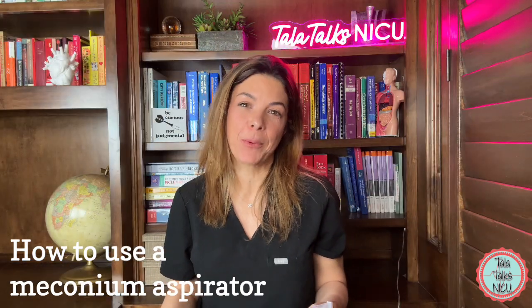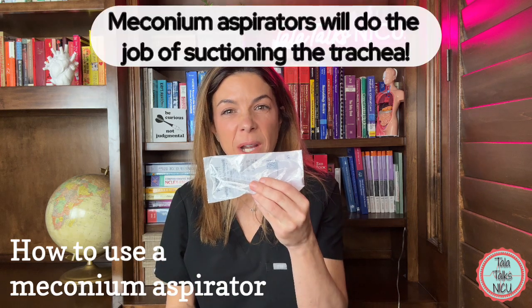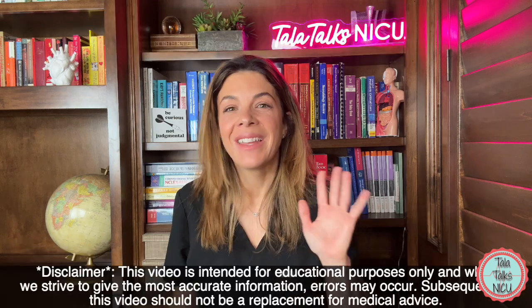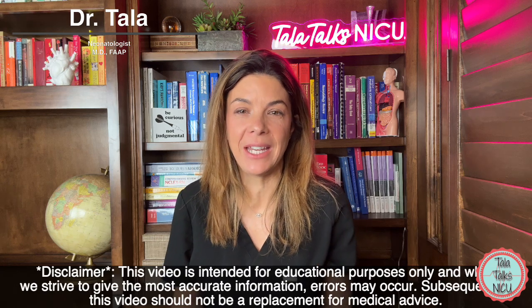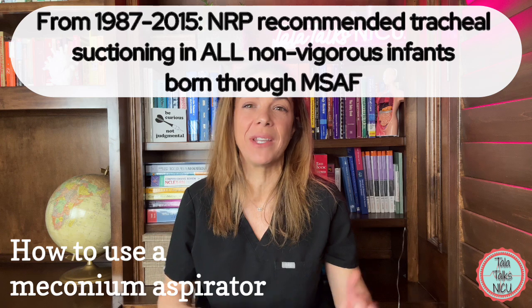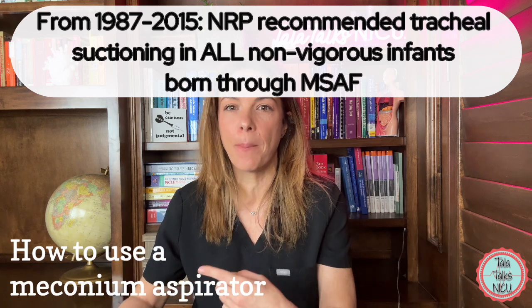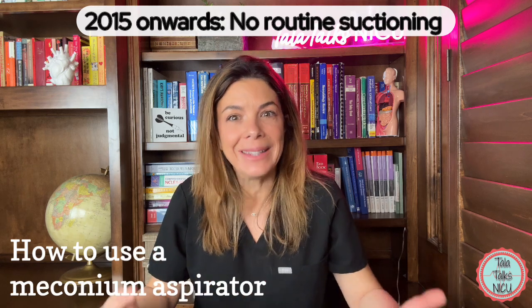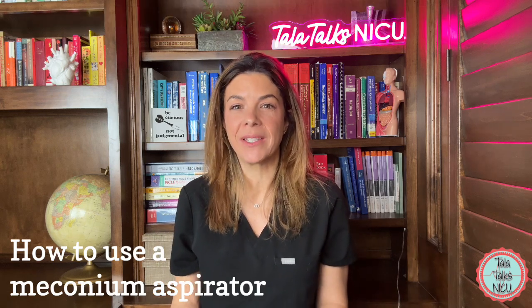Luckily, meconium aspirators were invented a long time ago. Have you ever seen one of these? Do you know how they work? And do you know when we use them? Hi, I'm Dr. Tala, and I've been a neonatologist for 17 years now. Interestingly, we used to use meconium aspirators all the time. Then, as the recommendations and NRP changed, we really hardly ever use them now. So I think a lot of people literally don't know how and when to use them — so that's what we're going to cover today.